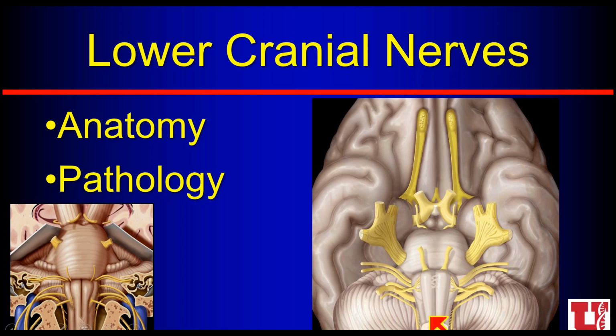This is very exciting for us because when we think about all these cranial nerves and their very intimate relationship with the skull base, this is an area where if we pay attention to both the CT and the MRI findings, we can sometimes tell you exactly what the pathology is. That's very important for us.